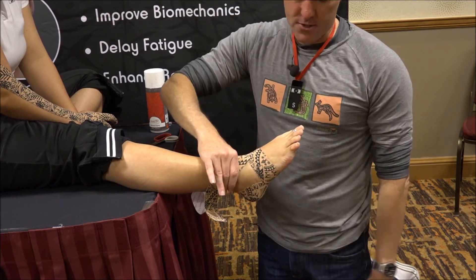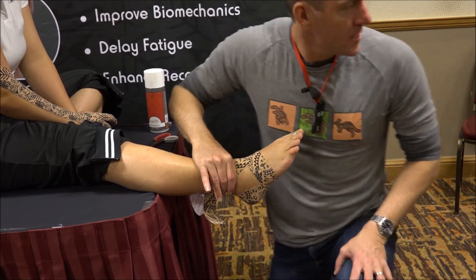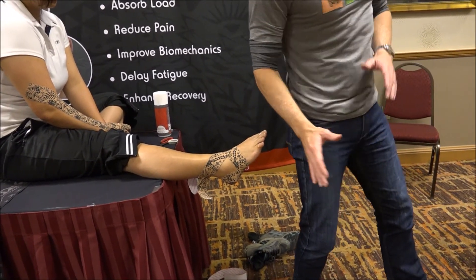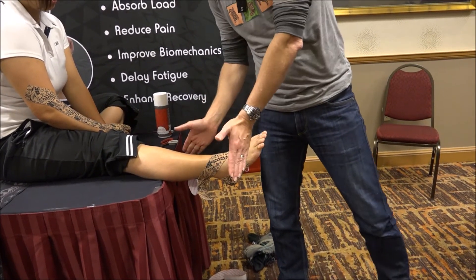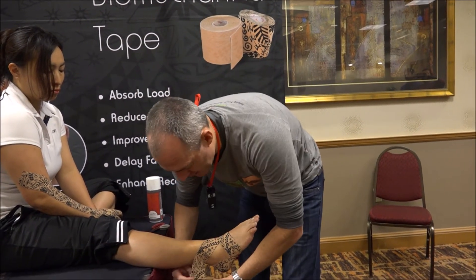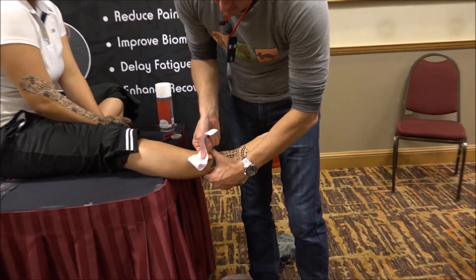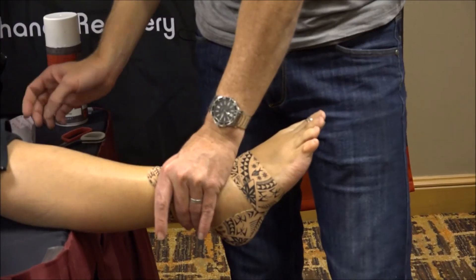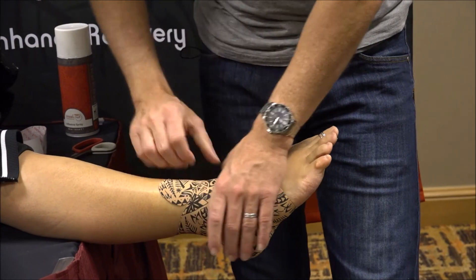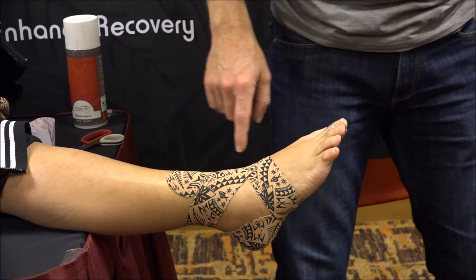If it was somebody who had a syndesmosis injury — those tend to occur with weight-bearing external rotation, often people getting tackled, and you get that inferior tib-fib joint issue and diastasis or syndesmosis injury. You could again — this is the force closure idea which we'll expand upon — come all the way around to create some compression through that inferior tib-fib joint through the recoil of the tape. And so if the injury was created that way, we want to go the other way, which is this direction.